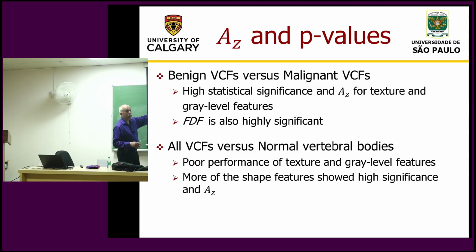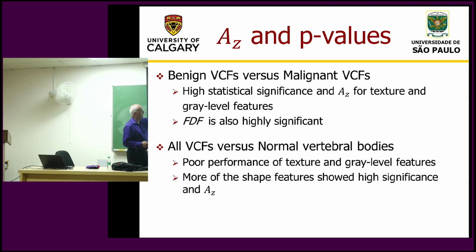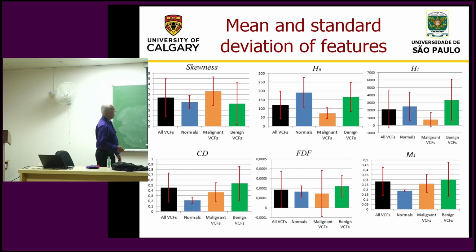After you do that, take those fractures and do benign versus malignant, and that is where the texture played a role, because the internal details have different texture in the two categories. Both boundaries could be rough, or boundaries could be rough in both cases. And the frequency content in the Fourier descriptors was also significant in benign versus malignant classification.